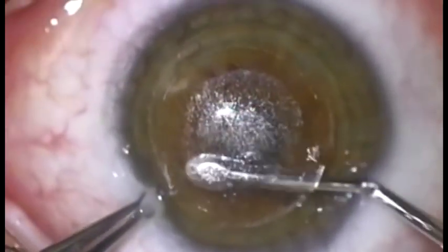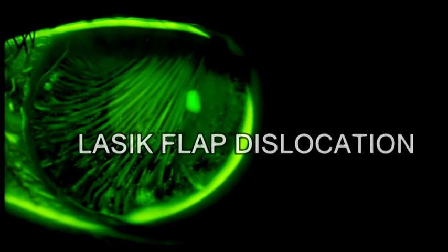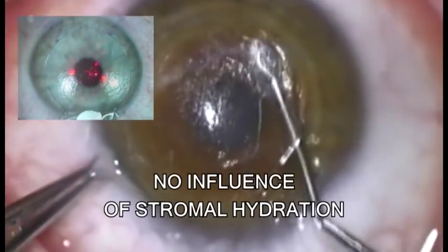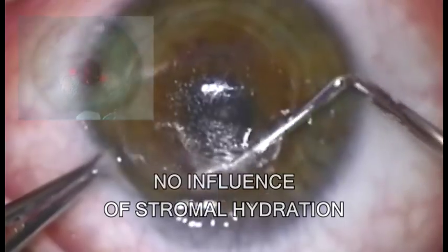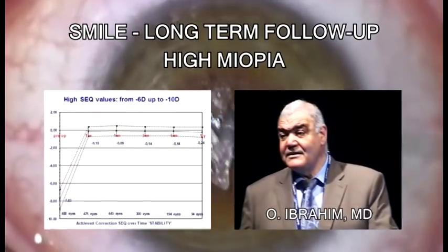The advantages of SMILE go far beyond the elimination of flap dislocation. In contrast to stromal photoablation, there is no influence of stromal hydration and room conditions, which may explain the improved accuracy for the correction of high myopia as reported by Ibrahim.